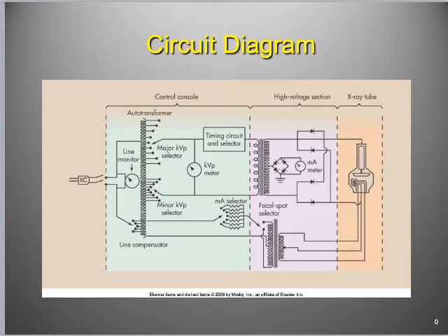So then when you press the button all the way down, it's just spinning. Yeah, when you hit all the way down, you energize this anode. And so now that it's energized, all the electrons try to jump over there. It's easier for them to jump across that gap than it is to get down the filament. So the path of least resistance now is to just jump over towards this positive charge.